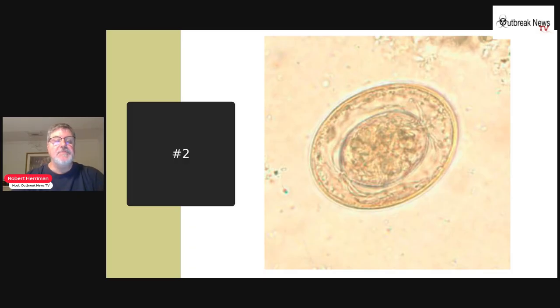A little bit of a description. This parasite we see is oval, small, with a size range of about 30 to 50 microns. On the inner membrane are two poles, from which 4 to 8 polar filaments spread out between the two membranes. The oncosphere has 6 hooks. What do you think?